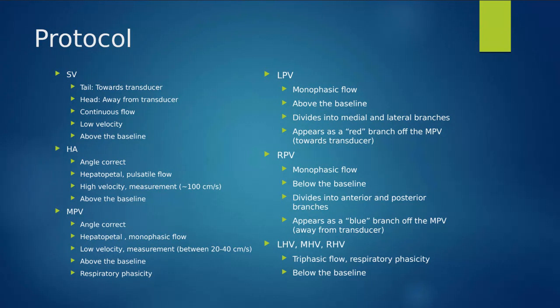We want to see slight variations in that main portal vein waveform. And when they hold their breath, it makes it appear continuous. But if they're breathing normally and it still looks continuous, that's going to be a sign that there's some type of obstruction or increased pressure in the portal system.